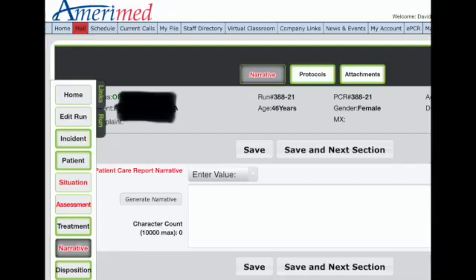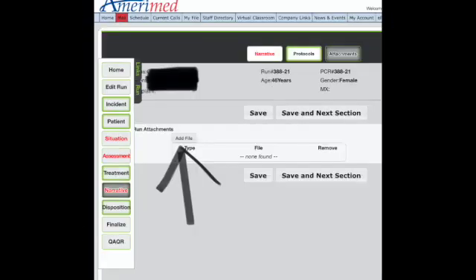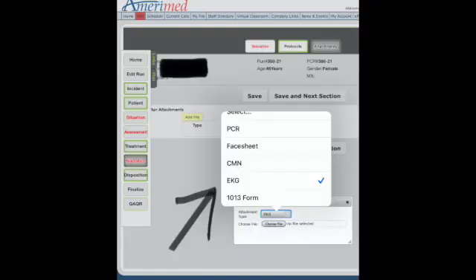Follow these steps. 1. Open Tablet Soft and return to the call. 2. Select the Narrative tab. 3. Select the Attachments header. 4. Tap the Add File button. 5. Select EKG from the drop-down menu.